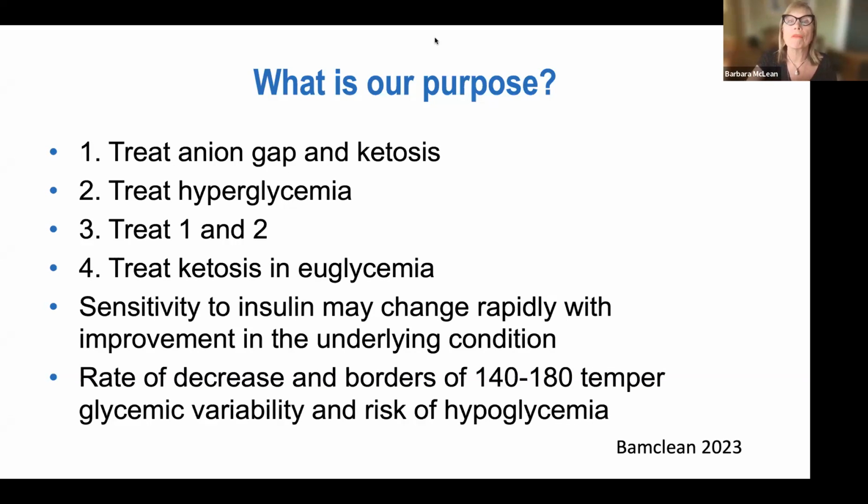Something that's really important for us to appreciate and understand about Glucommander, which sometimes doesn't seem to be a constant for us, is that when you order an insulin drip on your patients, you will order a multiplier. That multiplier, the initial multiplier, is where we start with rate calculation for insulin based on the patient's blood sugar.